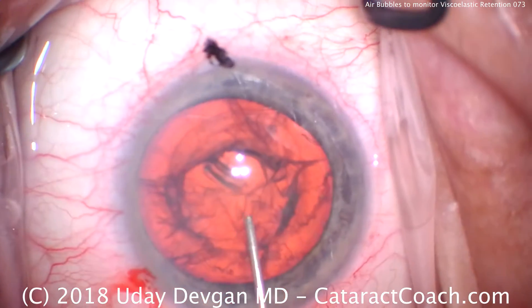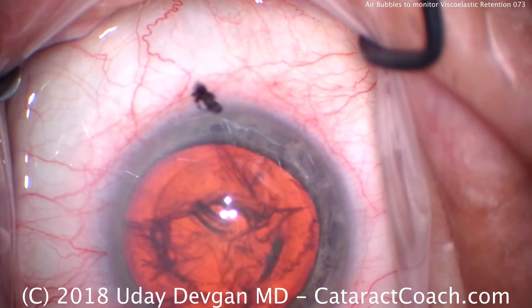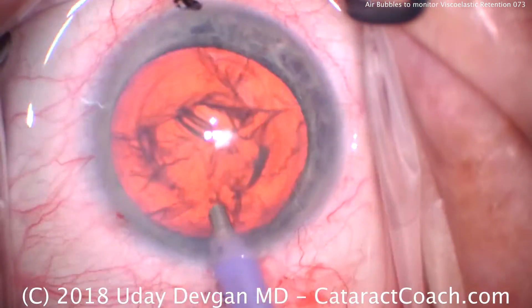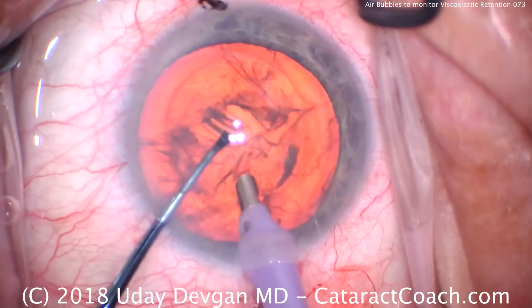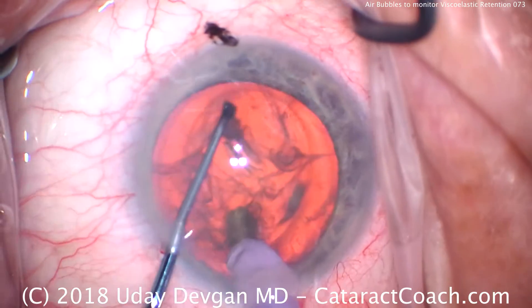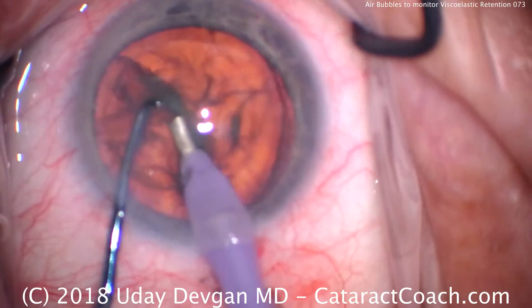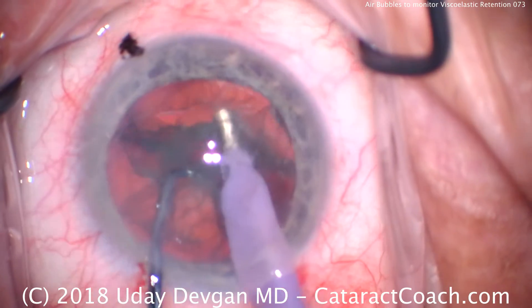We're going to coat a little extra dispersive viscoelastic there in the center. Don't worry at this point that you can't see the air bubbles — they are there. We'll see them again at the end after the cataract is removed. So we'll do a quick chop technique: buzz the phaco probe into the nucleus, chopper goes in as well, bring them together and apart, and take our time to fully separate the two halves.